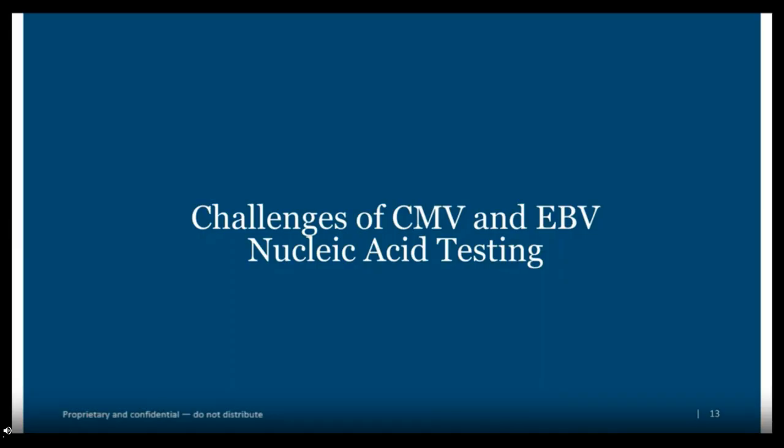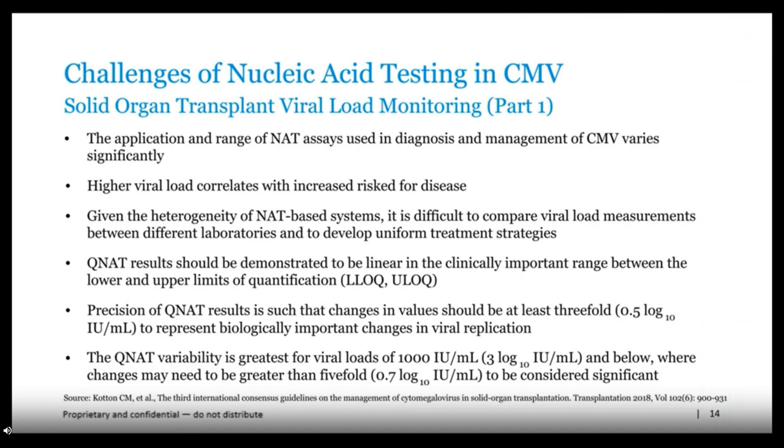Let's talk a little bit about some of the challenges associated with viral load testing for CMV and EBV next. The application and range of nucleic acid amplification tests used in the diagnosis and management of CMV varies significantly.